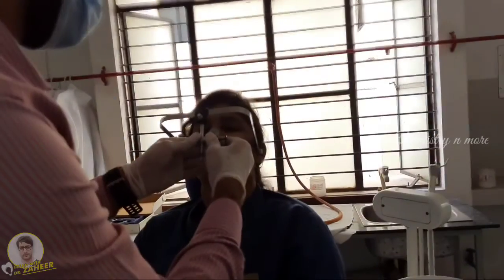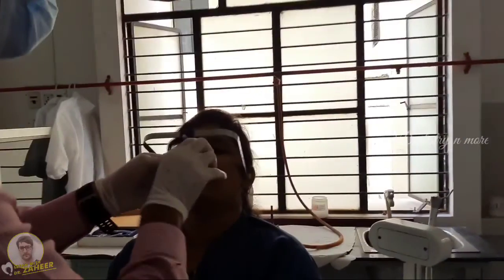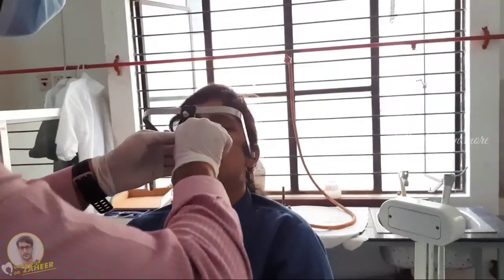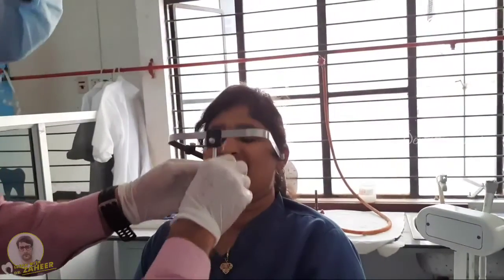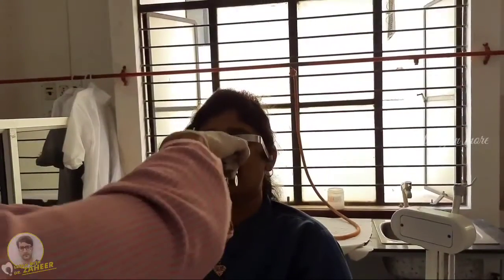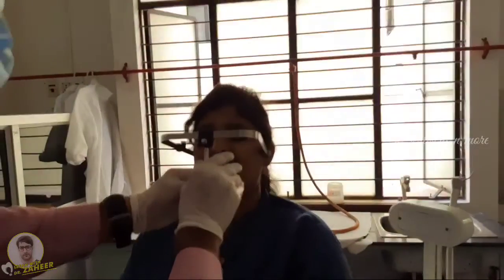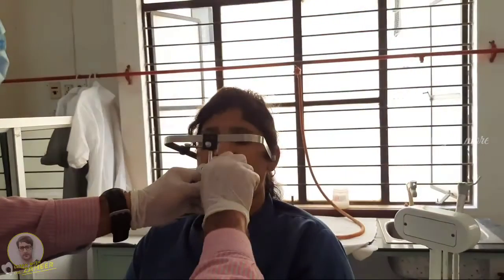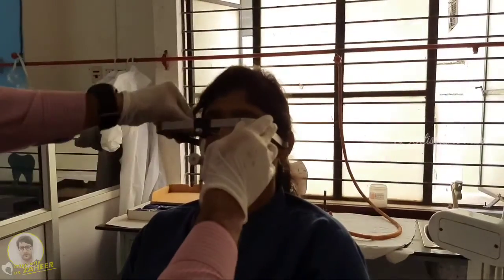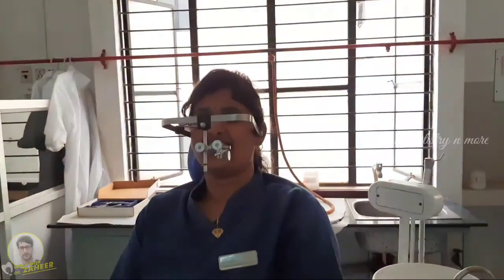Next I'm tightening screw number two, which orients the midline of the facebow with the midline of the patient or the occlusal rim. At screw number three I'm positioning and tightening the facebow in the anterior-posterior position. I'm rechecking and ensuring that all screws are tight — we don't want any screws to be loose at the end of the recording. I'm verifying the position of the U-shaped frame, rechecking at screw number two, and verifying the midline again. I'm tightening screw number three, ensuring the orbital frame is correct. That's how a facebow record is made.